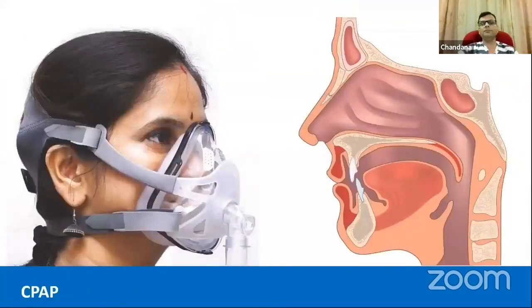So basically, there are two main varieties of NIV. This actually started with patients with sleep disorders like obstructive sleep apnea. People wanted to keep the pressure inside the throat fairly high so that it won't collapse during sleep. These devices originated in the domestic environment and later came to hospitals. Most of the devices in Sri Lanka, because of the lack of certain mask types, are getting an older category of masks, so you have to be careful when you use them. I'm going to touch upon all those types of masks.